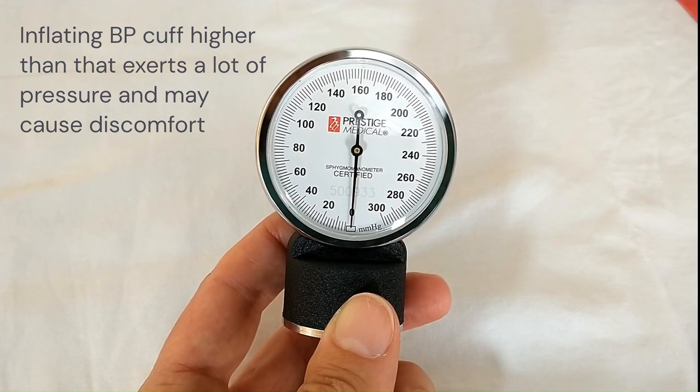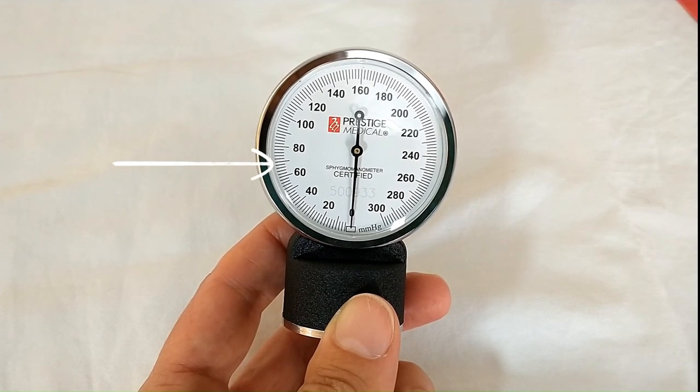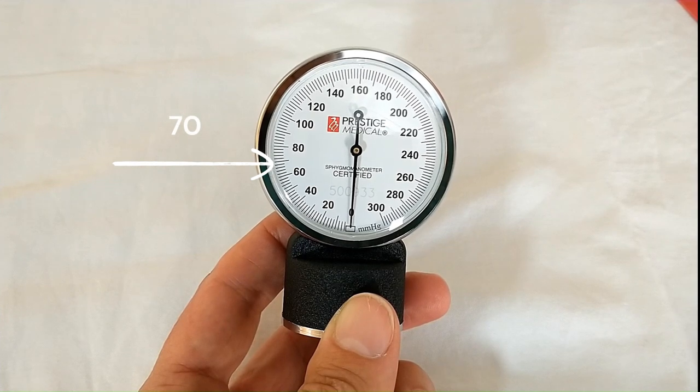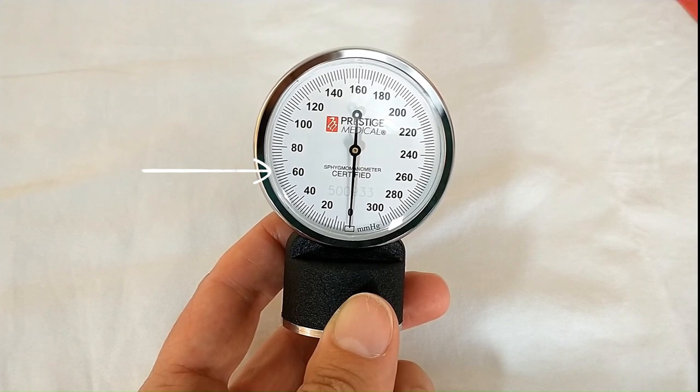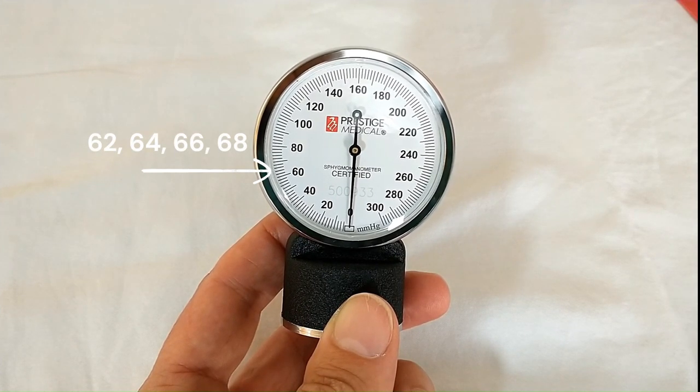Now take a look at the dials in between. So for example, from 60 to 80, there is a bigger line that says seven, that would be 70, and then in between we have smaller lines in increments of two. So that would be 60, 62, 64, 66, 68, and 70.